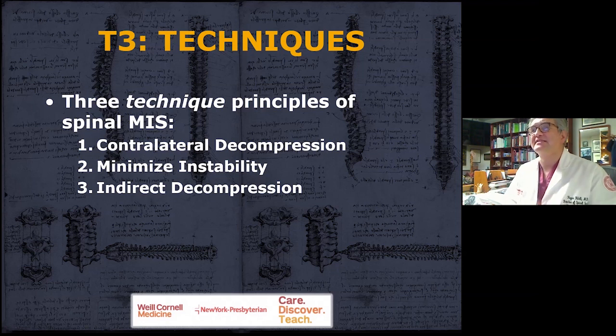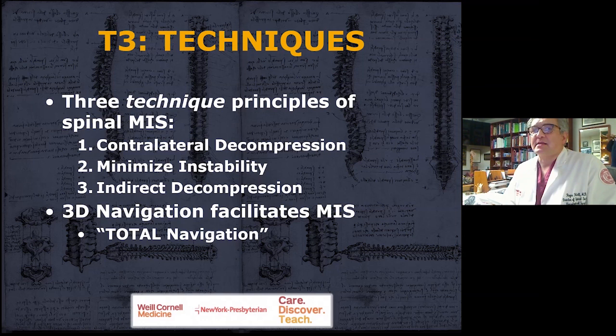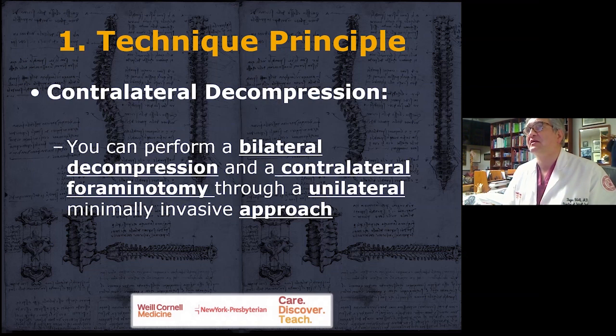Those are all things that you have to know about. The other thing, which is really more technology as well, is navigation. And how can you incorporate navigation, contemporary modern navigation, in order to facilitate your surgery and make it safer. Now, let's talk first about contralateral decompression.